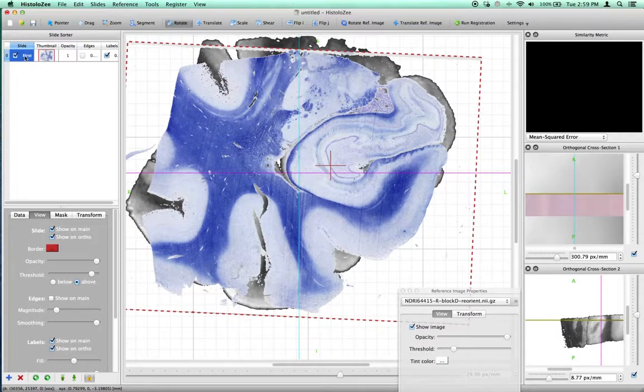And if I click on any image, the crosshairs immediately jumped to the beginning slide coordinate or K coordinate of that image. So since this image actually has some thickness, moving the crosshairs along the image here doesn't change the histology at all, but it does change the MRI behind it, as you can see.